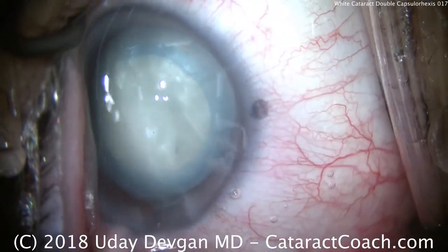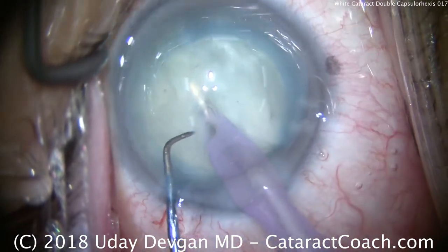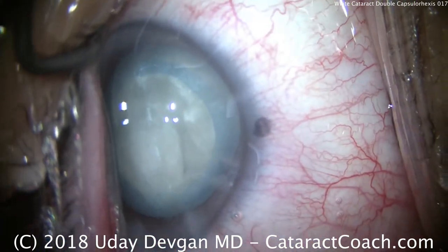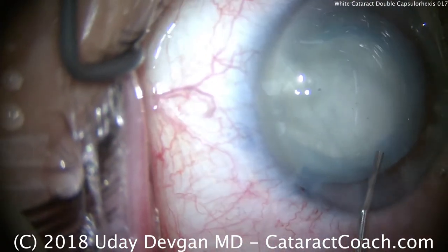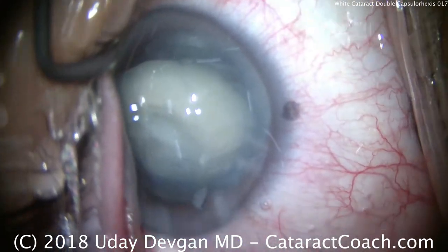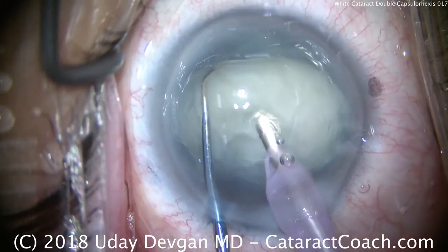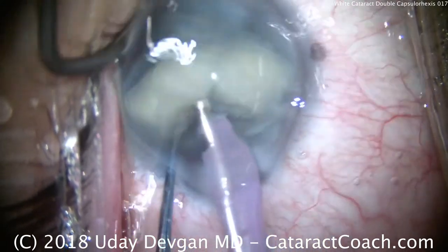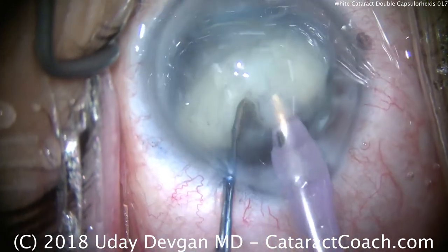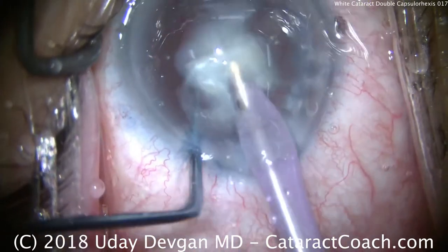At this point, we can proceed with FACO as normal. We'll buzz into the nucleus, clean up some of this cortex first, clean up that milky stuff. I realized going in here, this whole thing is soft. We're not going to chop — we've got to prolapse it out of the bag first. So I used some viscoelastic to bring the lens out of the capsular bag. It's reasonably soft; the chopper goes around it, and we break it into pieces. Not a super dense nucleus, so not too much FACO energy is required. Just keeping the pieces in front of the FACO probe — the chopper is feeding towards the probe — and we'll be done with nucleus removal in just a matter of seconds.